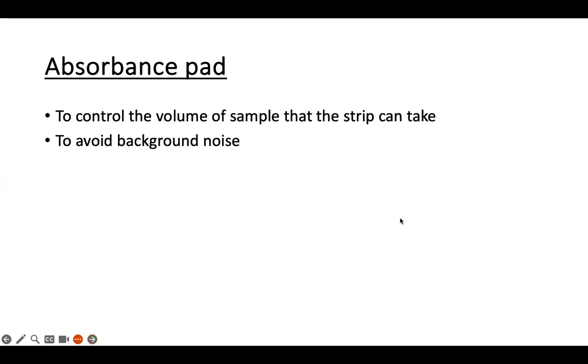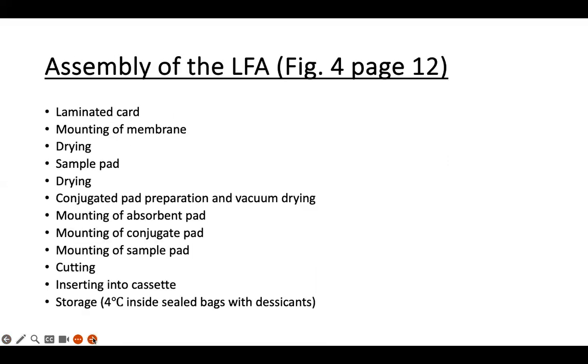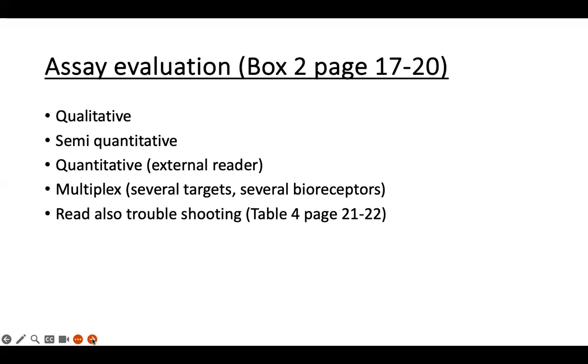The absorbent pad is the last part, so that one helps the capillary movement, as well as helping to avoid the back flow of the solution, okay, of the fluid, sorry. Okay, so this is the whole thing. Tomorrow you have the laminated card, mounting, drying, sample pad, okay, storage. All right, assay evaluation you will also do tomorrow.